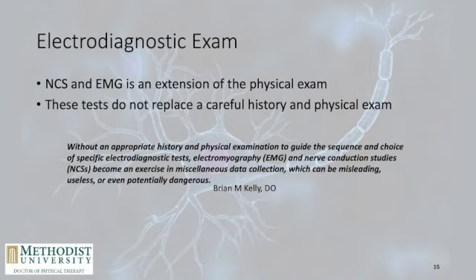So please don't think, oh, I can just do an EMG or NCS and really get the full idea. It's just like taking an x-ray on someone without knowing how they got hurt or what pain they're having. So we need to do all of our due diligence here. We need to be very good medical screeners.